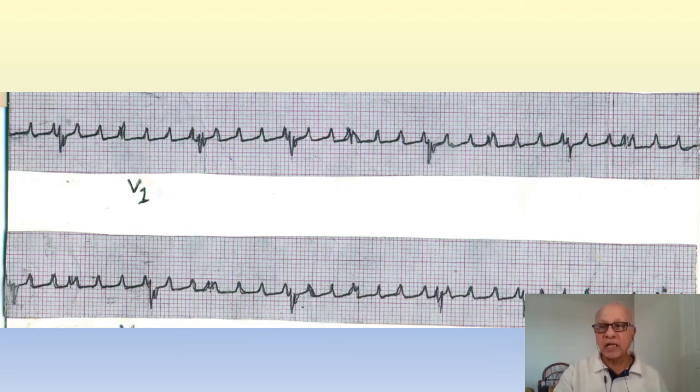Now, what could have been the underlying illness in this young girl? What do you consider? In India, from where I am, naturally, the first thing you always think of in a young girl of 15 who comes with palpitation and an arrhythmia, especially an atrial arrhythmia, is rheumatic valvular disease. Of course, this patient also had rheumatic multivalvular disease. So one point here is the patient was complaining of palpitation, but the resident did not find anything wrong with the pulse. So don't ignore that.